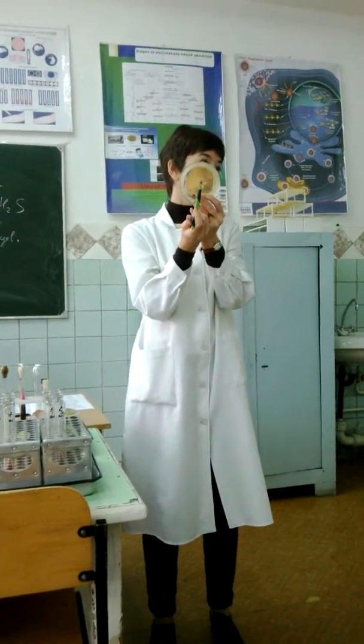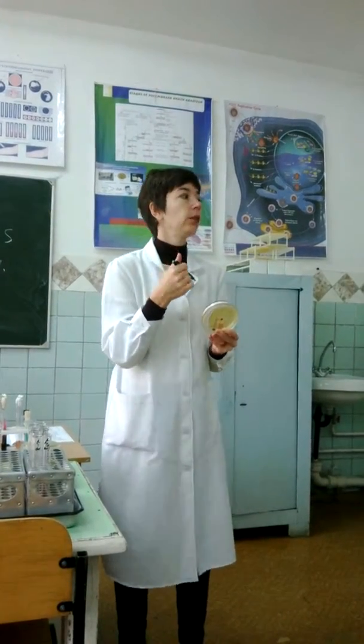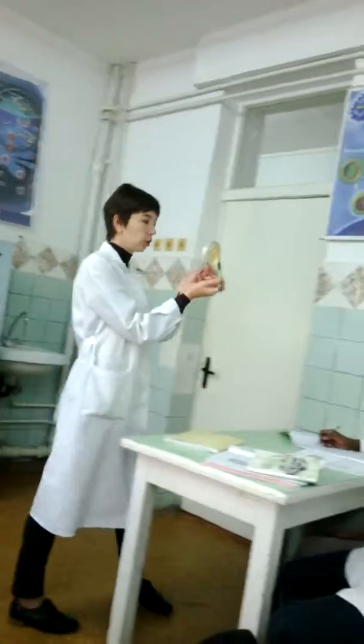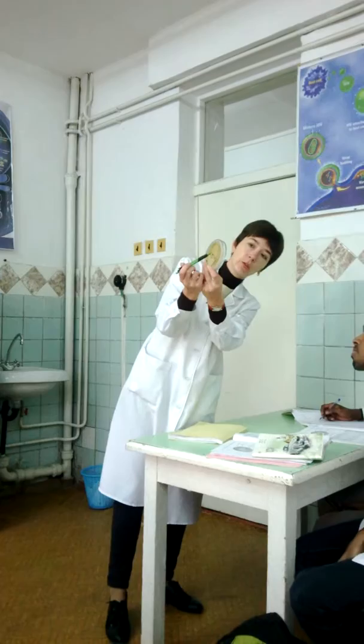Okay, then, after one day, we read results. If bacteria produce toxins, exotoxins diffuse in the agar, and the antibody diffuses too. In the place where antibody and antigens react, a line of precipitation forms. And we may obtain a line of precipitation.